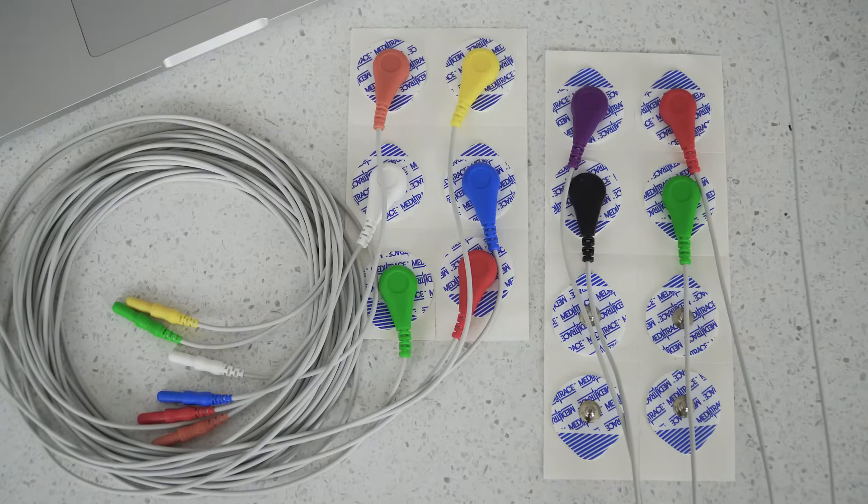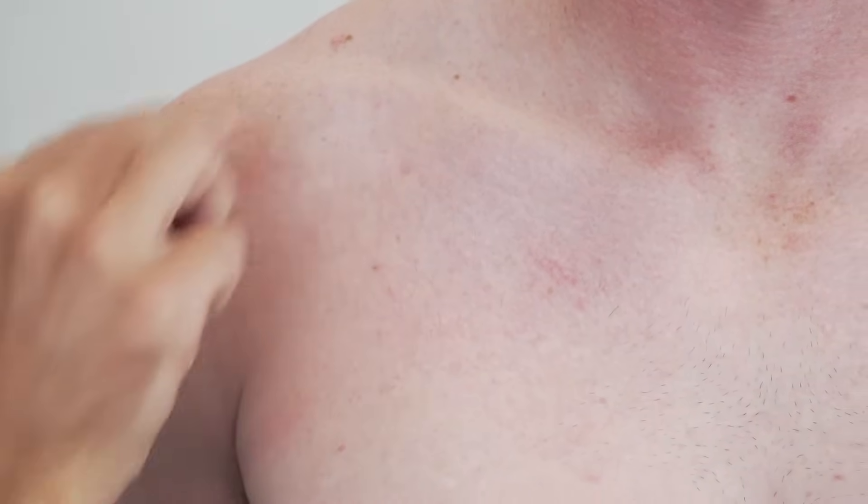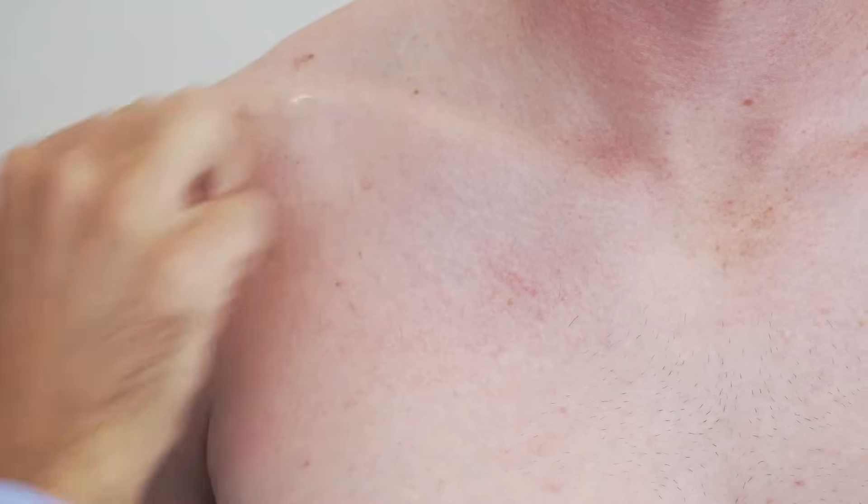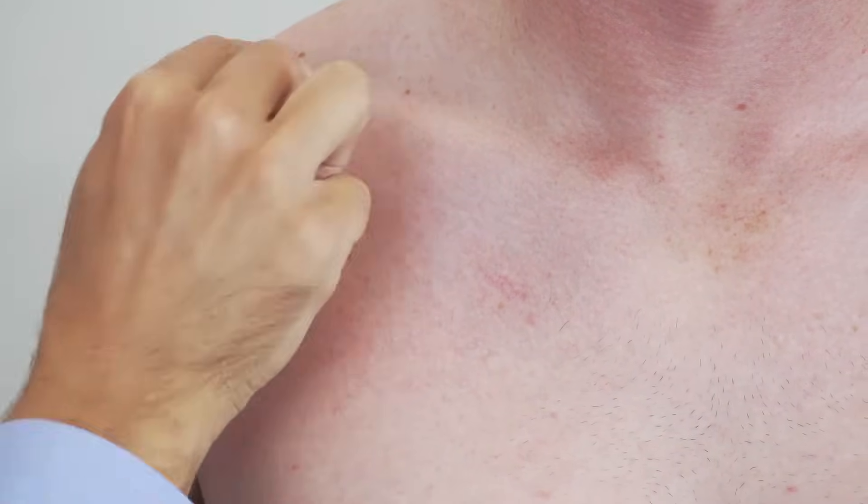Before placing the electrode, it's really important that you prep the skin. We use these skin cleansing swabs, which are actually just alcohol swabs, and we just wipe down the area really well. This is just to remove any oils which can cause drift in your signal.